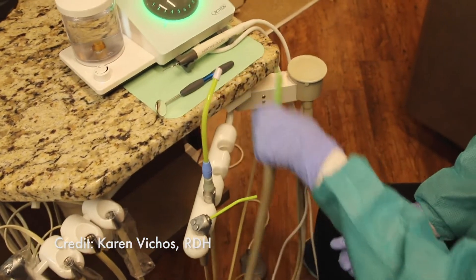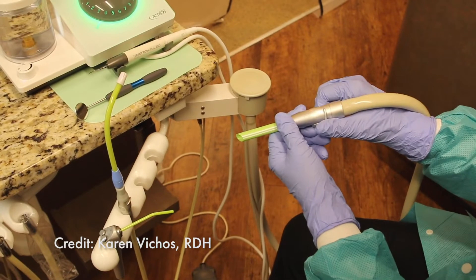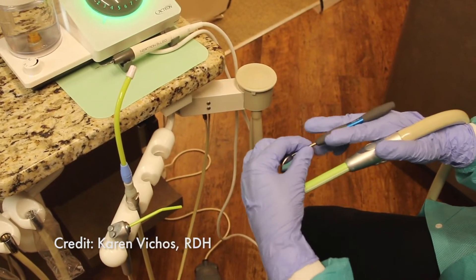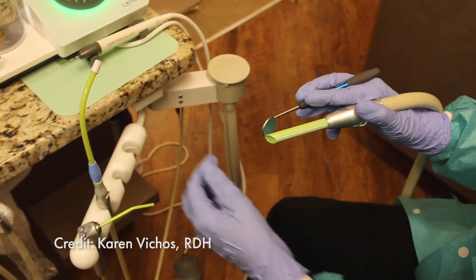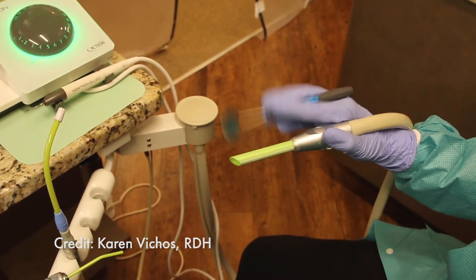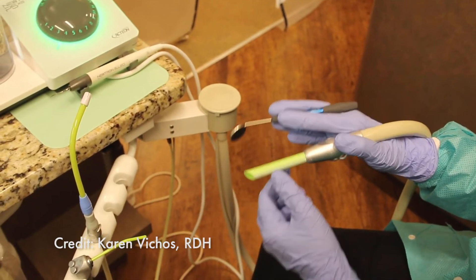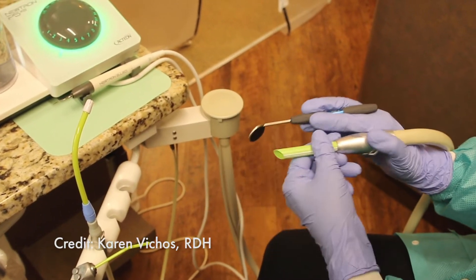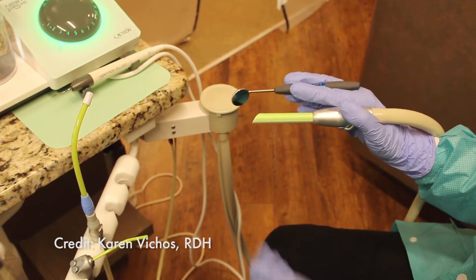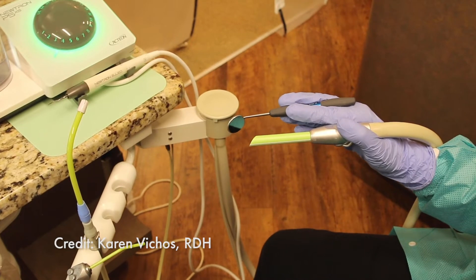I take my HVE and I hold it between my thumb and my index finger, with the lever closest to my thumb. I then take my hand mirror and I place it between my index finger and my middle finger, and I also use my ring finger as a rest. This way I am able to move the mirror back and forth as needed for better vision. I like to make sure the mirror is just slightly higher than the tip of the HVE — this gives me a clear view of my mirror, and as the tip is slanted, it also helps keep moisture off the mirror.